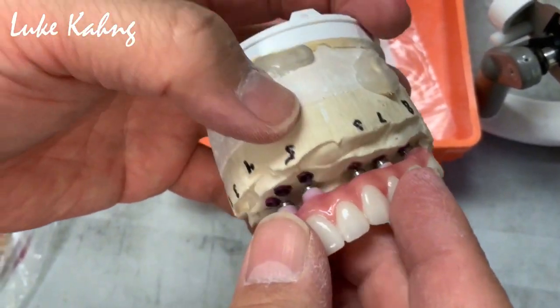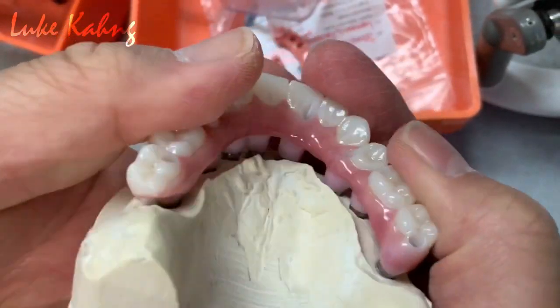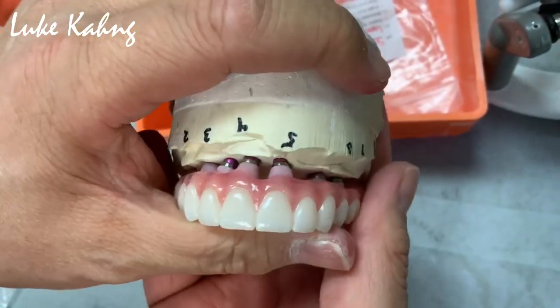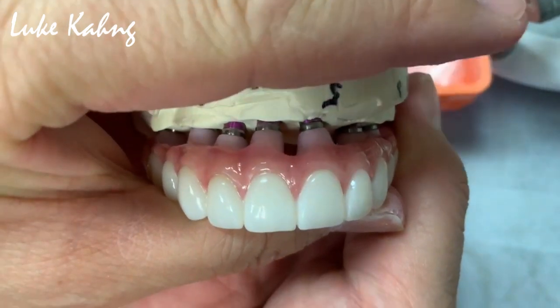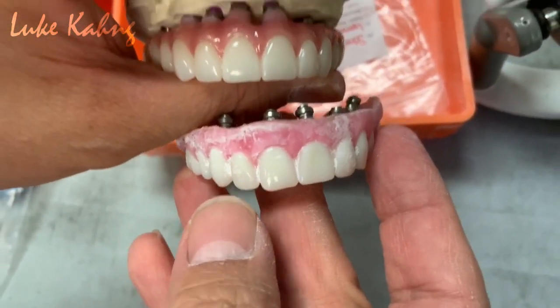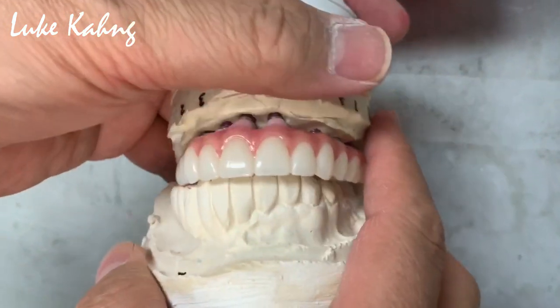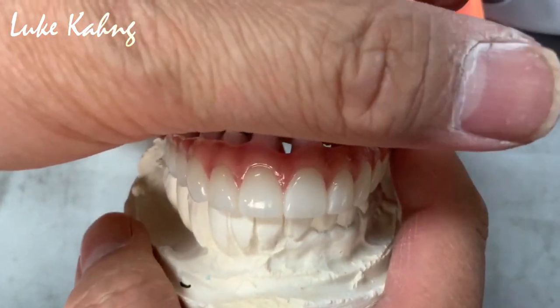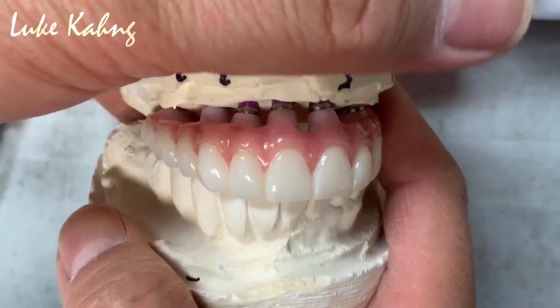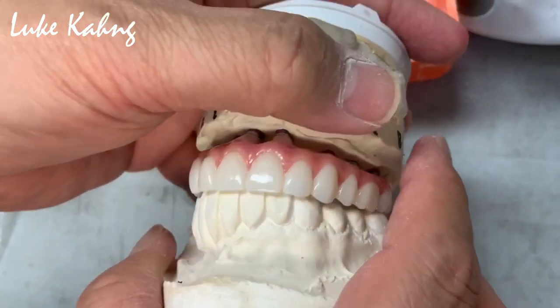8 implant. Quite a bit. So we just fit it, cement carefully. Looks good. Awesome, nice glistening color. Okay, before. And here is the bite. Now let's see if it's working. Great contour. Thank you.